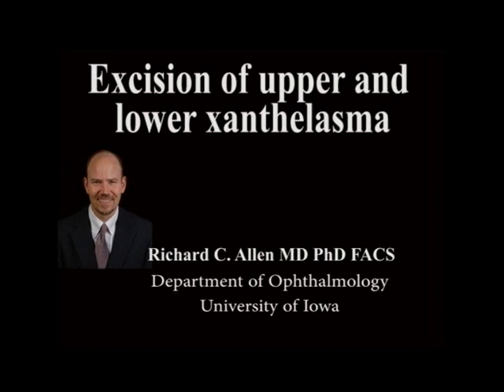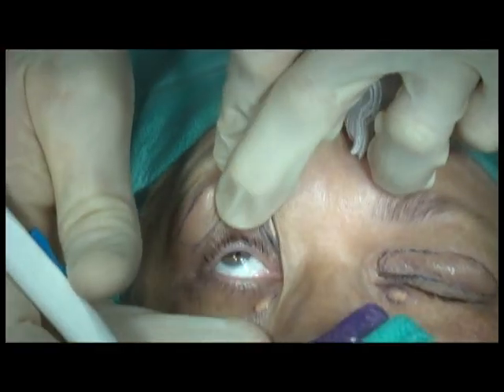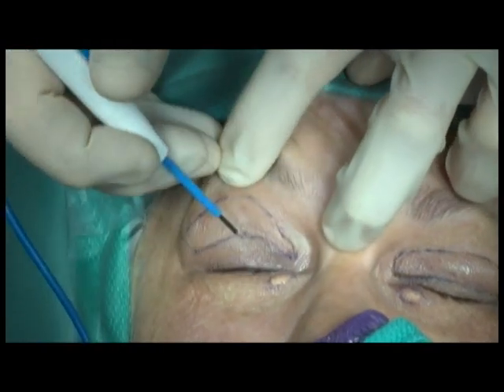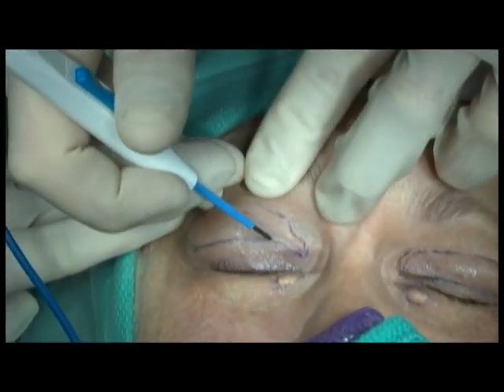This is Richard Allen at the University of Iowa. This video demonstrates excision of bilateral upper and lower eyelid xanthelasmas. In this case, the excision of the upper lid xanthelasmas will be incorporated into upper lid blepharoplasty incisions.